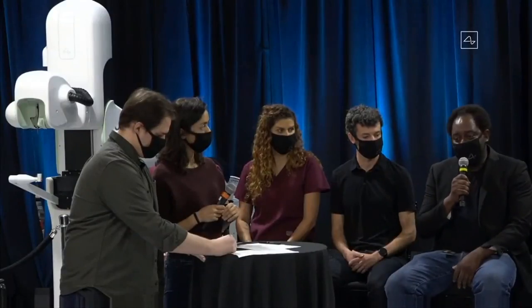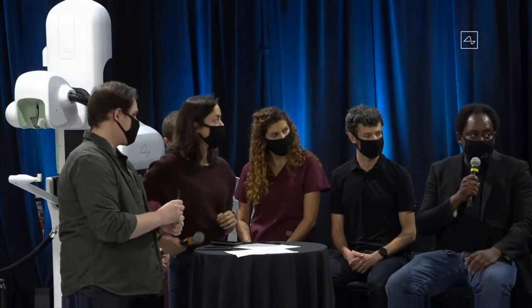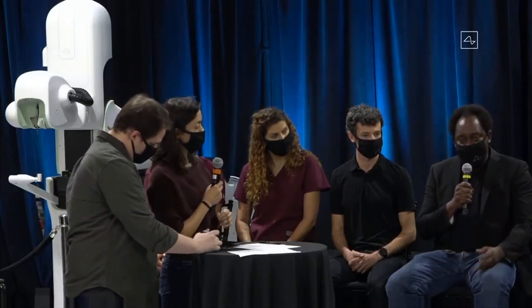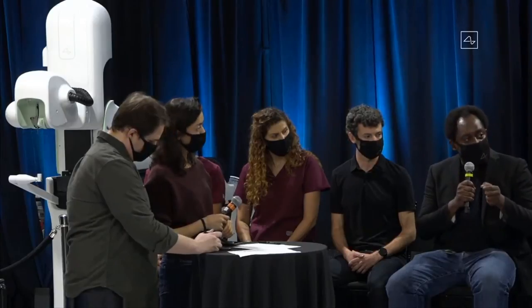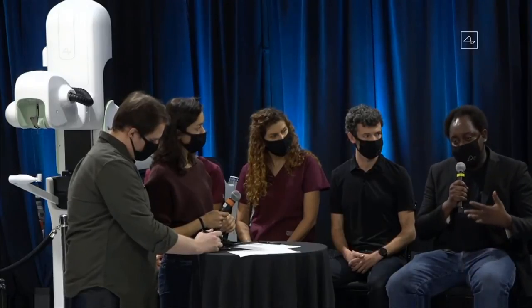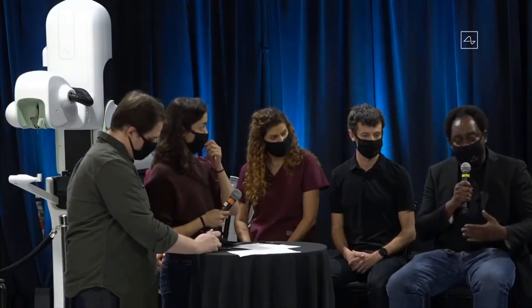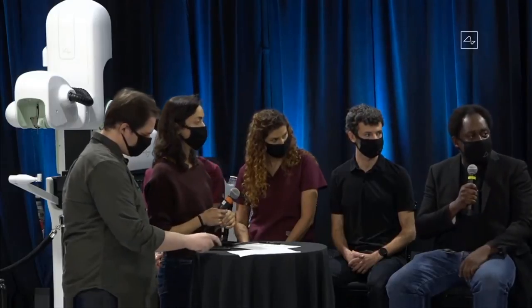Would you say? Yeah, I totally agree. And apart from its electrical properties, it also helps with adhesion between the metal layers and the polymer substrate. Another thing we're also looking at is that since we're reducing the electrode dimensions, the electrode site, the actual site that speaks to the neuron, also has what we call high resistance to the signal. So we look into material engineering that will reduce the impedance at that interface so that we can have a very small electrode site but still be able to speak clearly to the neuron.